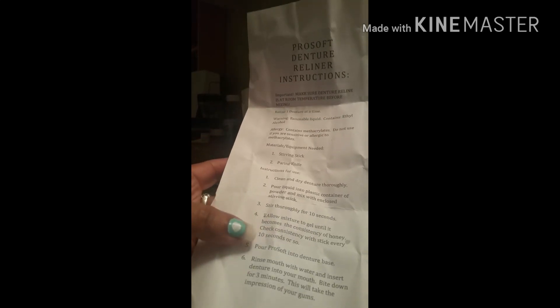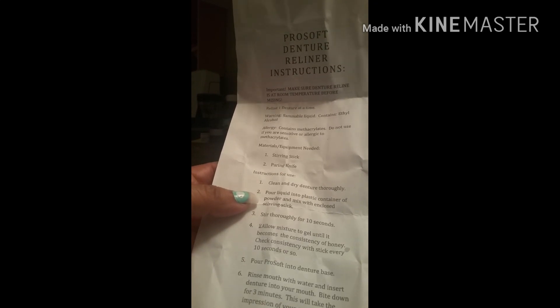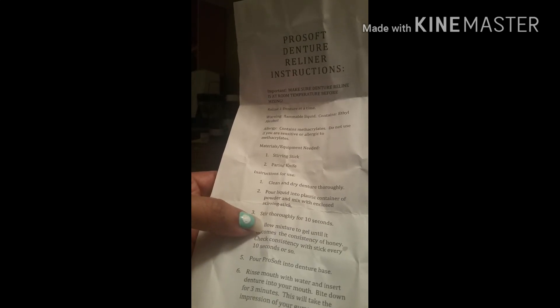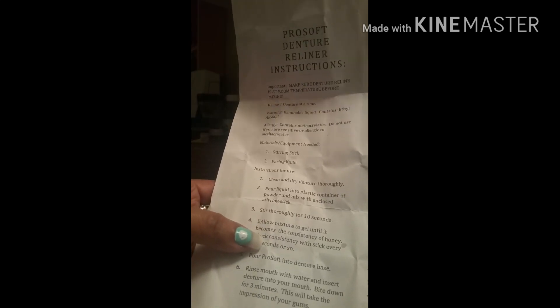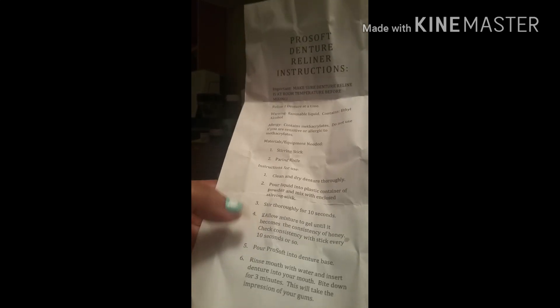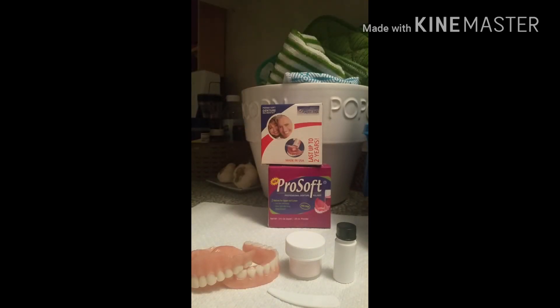It's very important that you know what's going on and what's expected in order to get the best out of the product. Step one: clean and dry your denture thoroughly. Pour the liquid into the plastic container of powder and mix with the enclosed stirring stick — stir thoroughly for 10 seconds. Allow the mixture to gel until it becomes the consistency of honey, checking with the stick every 10 seconds. Then pour ProSoft into your denture base.